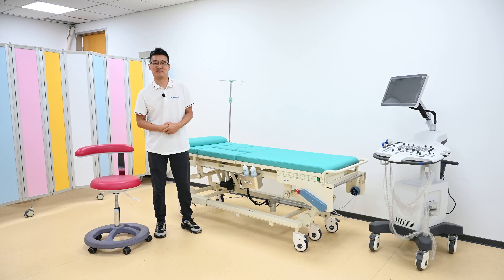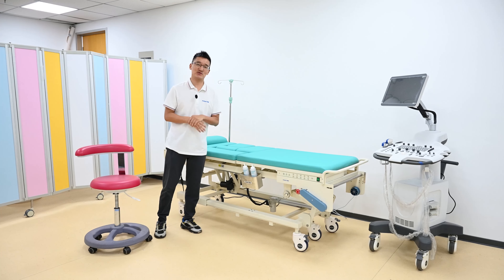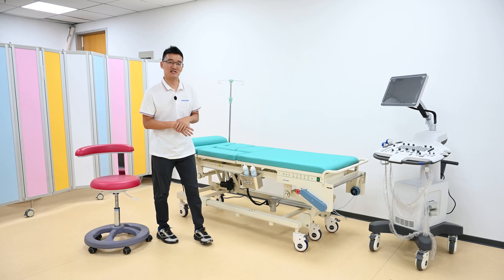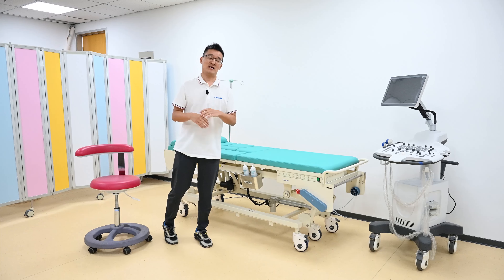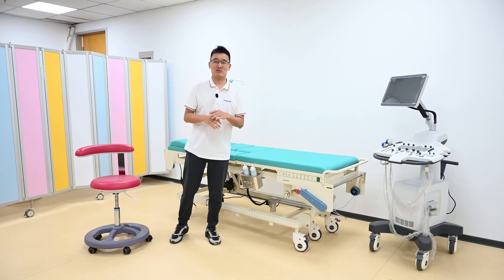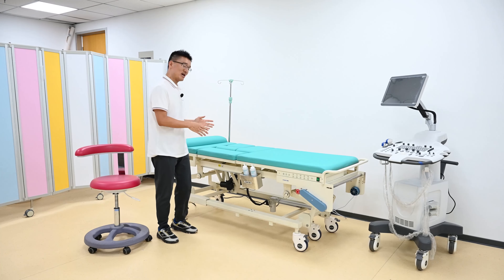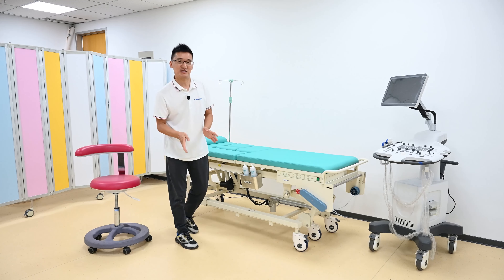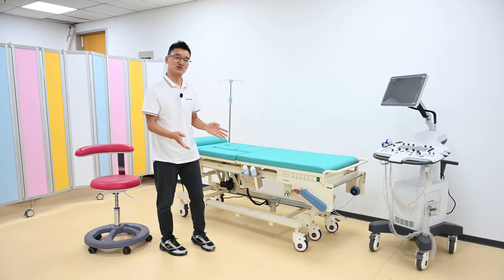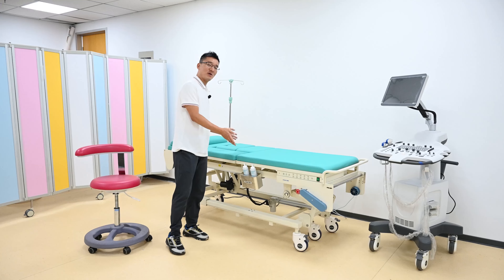Hello, it's Kai from Medica. In this video I will introduce a very intelligent examination couch specially designed for the ultrasonic exam room. Of course it can be used for the general exam room as well. The table is very comfortable for the patient and very convenient for the doctors to use. Let me introduce the humanized design one by one.